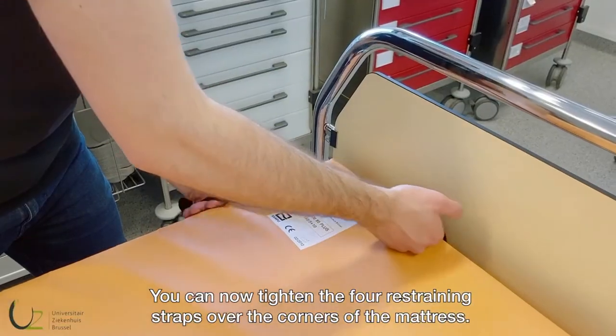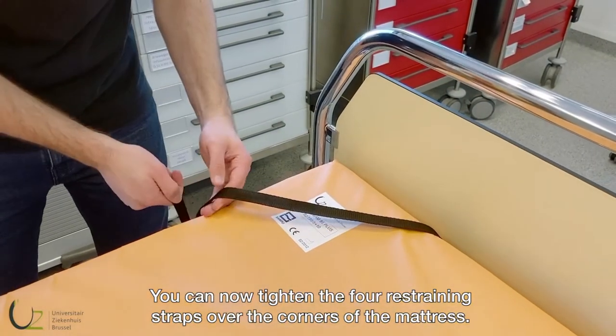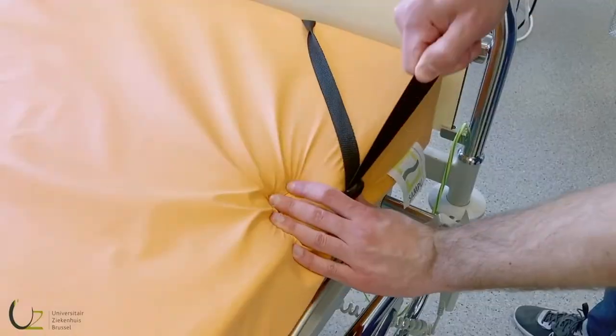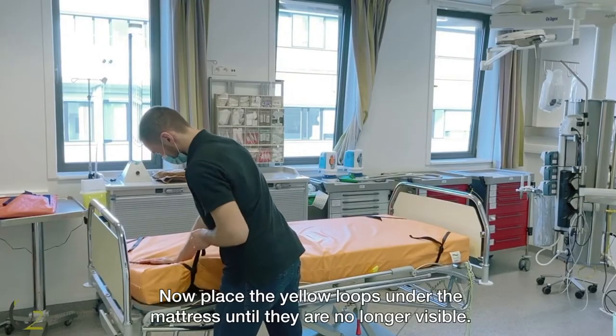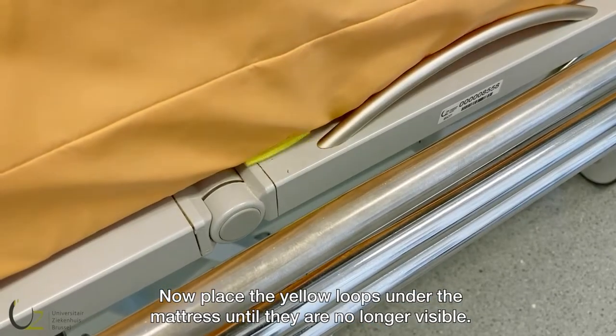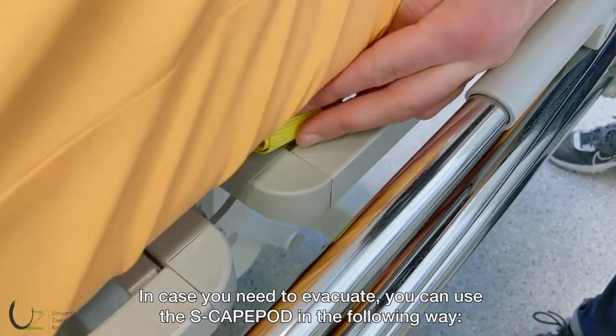You can now tighten the four restraining straps over the corners of the mattress. Make sure the clips are on the side of the mattress. Now place the yellow loops under the mattress until they are no longer visible.